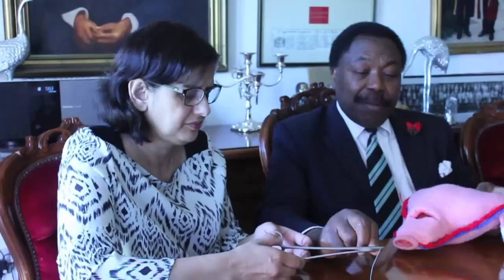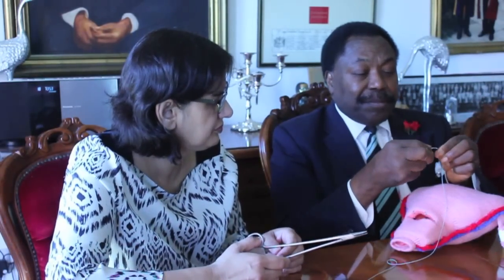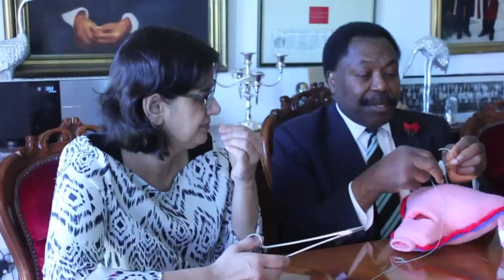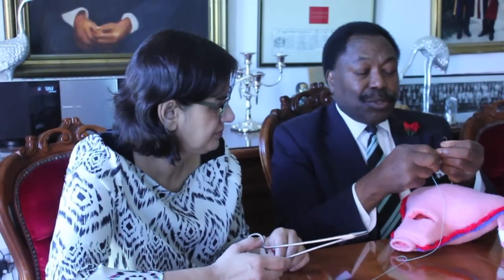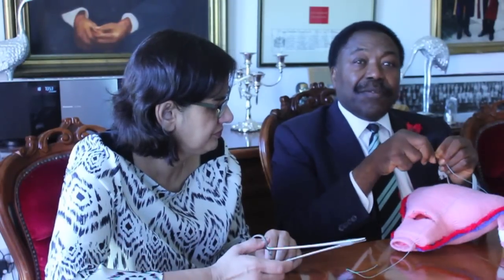Secondly, the suture material ideally should be Vicryl number one, mounted on a 70 mm curved needle with a suture length of 90 cm to allow enough suture material available for the purpose.